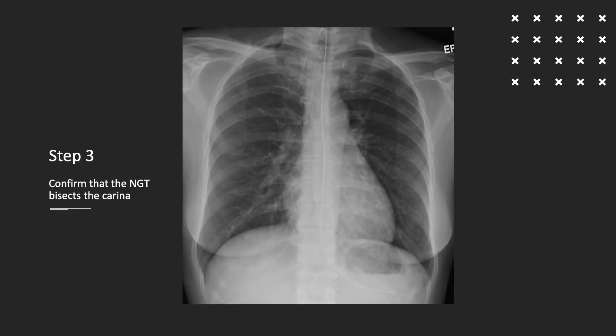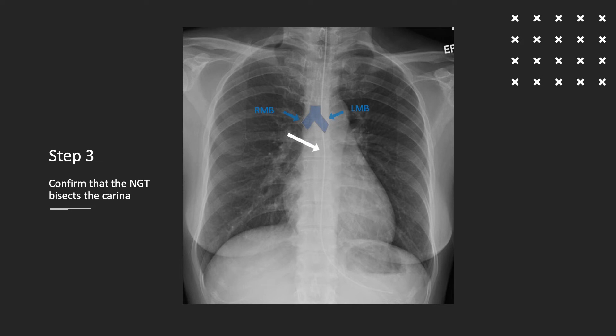The carina should be identified as the termination of the trachea as it bifurcates into the right and left main bronchus at approximately the level of T4 or T5. The nasogastric tube should be seen to bisect the carina. The right and left main bronchus should be separately identifiable, and the tube must not follow the course of the right or left main bronchus.